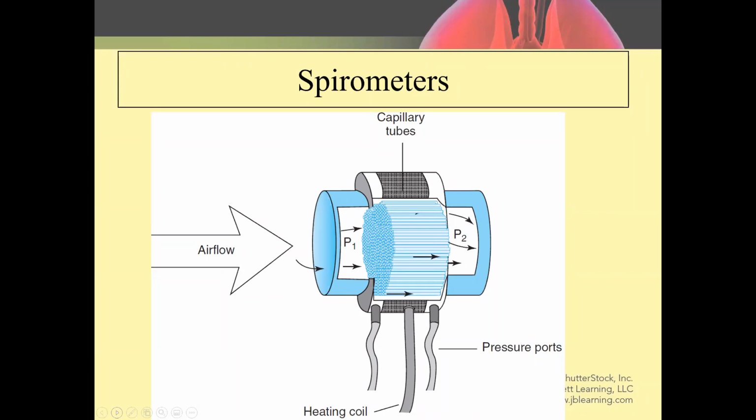So there's different measures that are done to help ensure that the equipment is properly calibrated. When I took my RPFT exam, they were very big on things like, when you do your quality controls, and the numbers tend to shift, they're within acceptable range, and then they shift out of the range, identifying what it's called and identifying what some of the potential problems are and how you fix them. Gets really, really a deep dive.